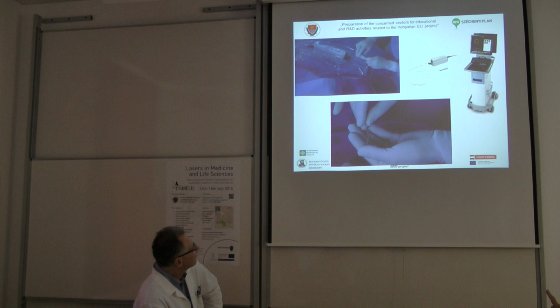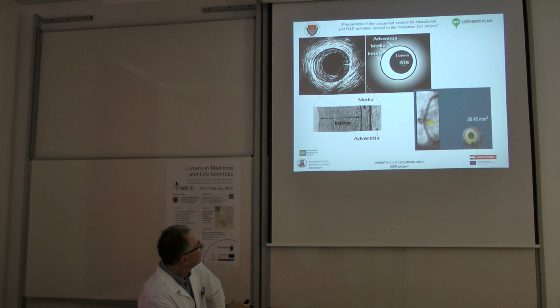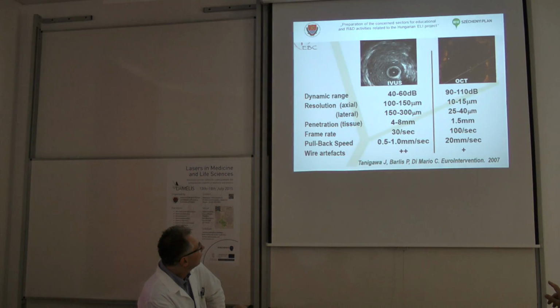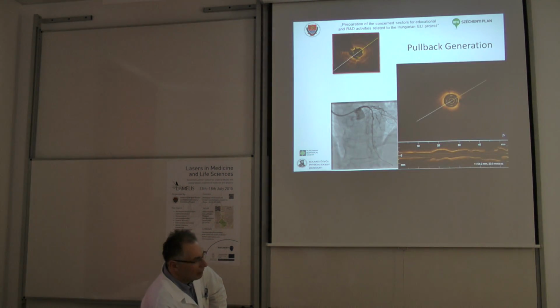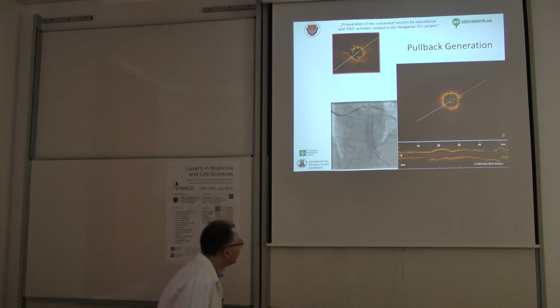You put the laser pointer. Yes, this is the one. No, it was an image from the X-ray camera, and you were showing the wire. And you commented along this wire, now we introduce the OCT. So my question, something similar, you're saying now I introduce the OCT probe. It was the X-ray image, and you were commenting on the guide wire. And you said, fine, now I introduce the OCT probe. So how do you realize that you introduce it, because you see only the guide wire here.